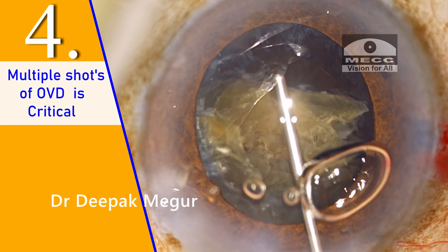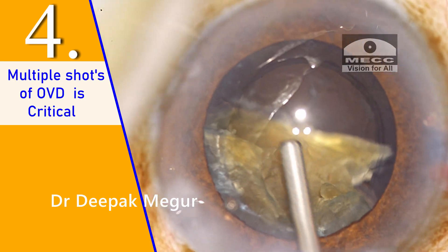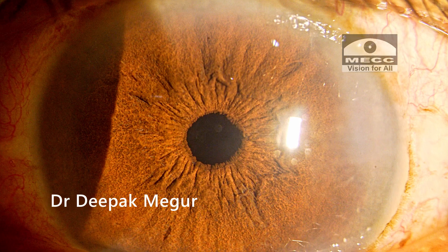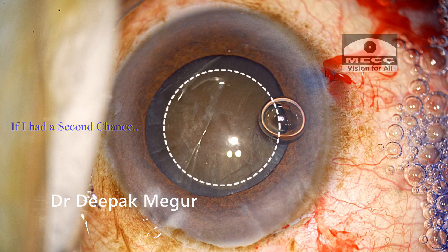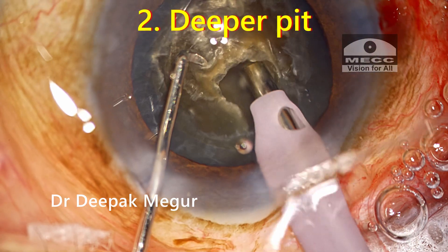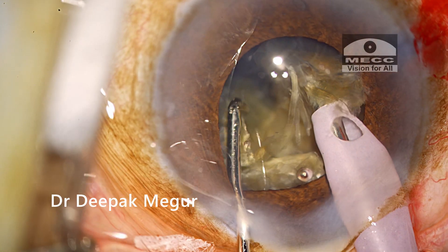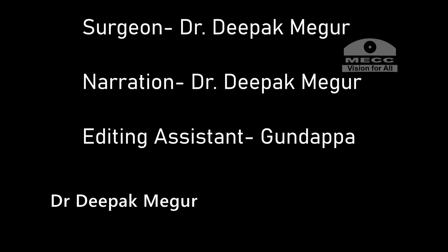Above all, patience is the greatest virtue in such cases. By following these principles, we can achieve clear corneas on post-op day one even in rock-hard cataracts. Given a second chance, apart from a slightly bigger rhexis, I would also create a pit much deeper — around 90% depth — so that the initial cracking maneuver would be more efficient and less stressful on the rhexis and zonules. Hope you found this helpful.